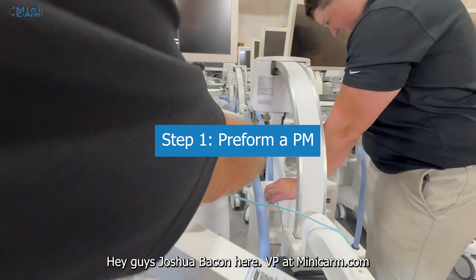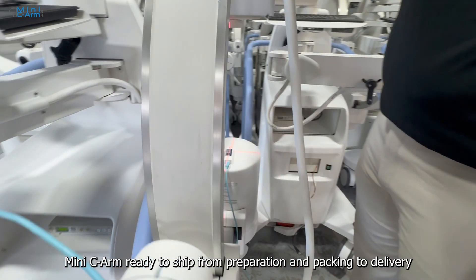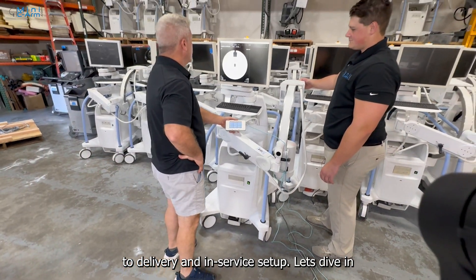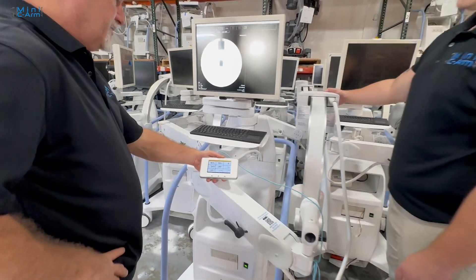Hey guys, Joshua Bacon here, VP at MiniCArm.com. Today I'm excited to show you the entire process of getting a MiniCArm ready to ship — from preparation and packing to delivery and in-service setup. Let's dive in.